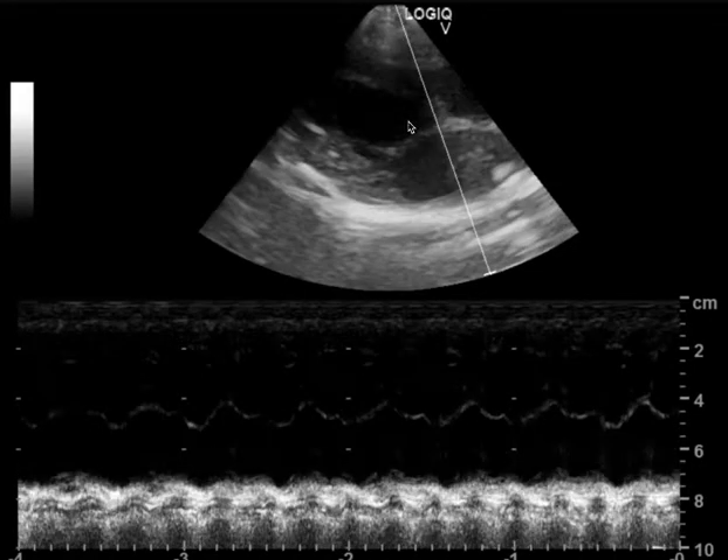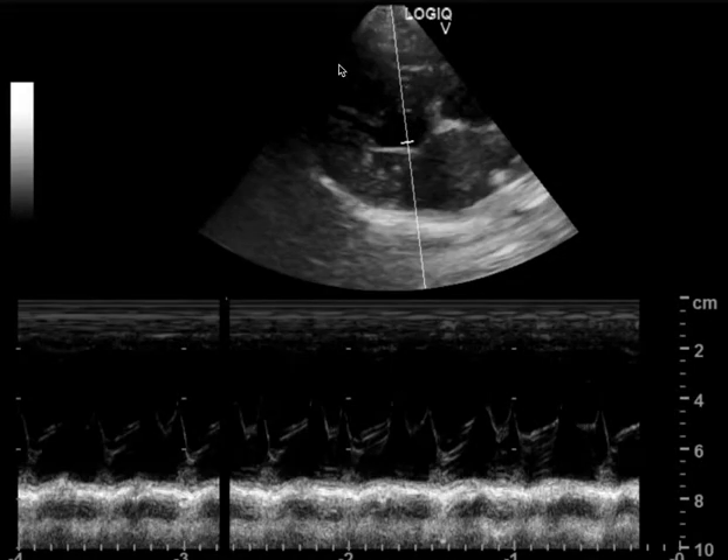For EPSS, the problem is you're not quite perpendicular to the ventricular septum and your septum is rounded. Again, you want to slide more dorsally towards the spine — that will solve both the aorta problem and the long ventricle issue. You also want to twist the probe away from you, which will lengthen out that left ventricle to get your EPSS. Your EPSS, LVM M-mode, and LA max all need a nice long left ventricle flattened across the screen.